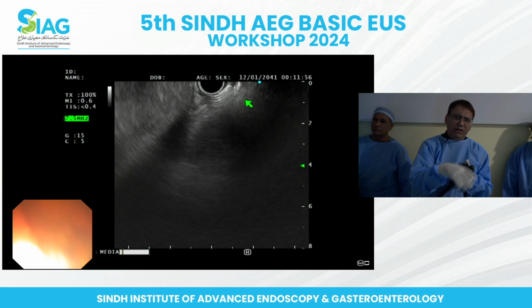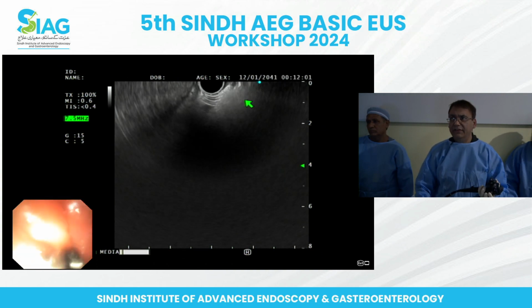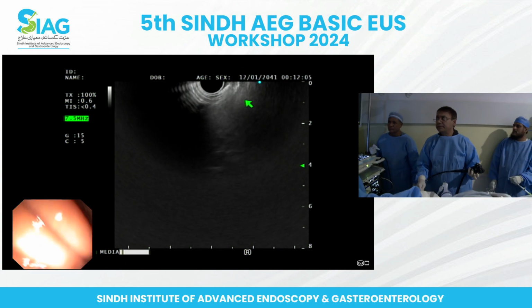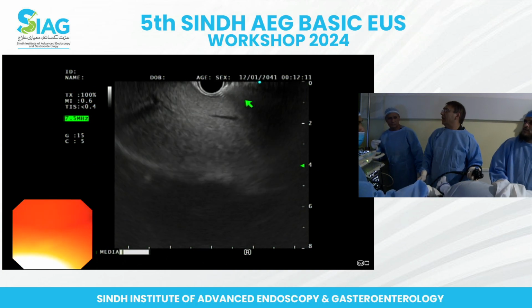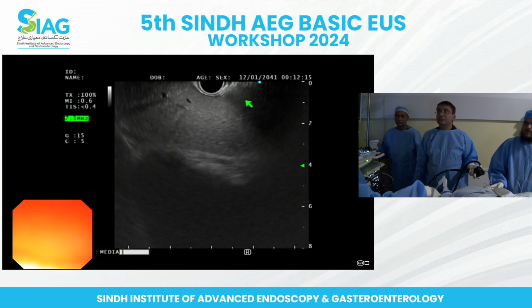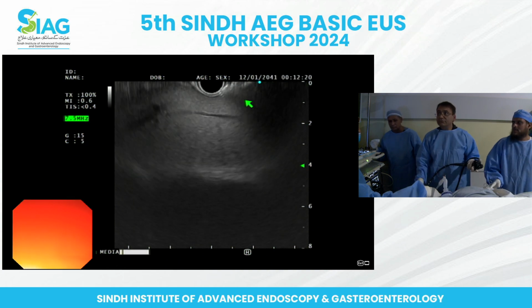Who is going to tell me, among the trainees, which segments are right anterior? And right posterior, which segments are those? 5, 6, 7, 8. No, that's 5, 6, 7, 8. Yes, that's the right lobe. What is the right anterior? Right anterior 5, 6. Okay. Anybody else? We have complete silence.